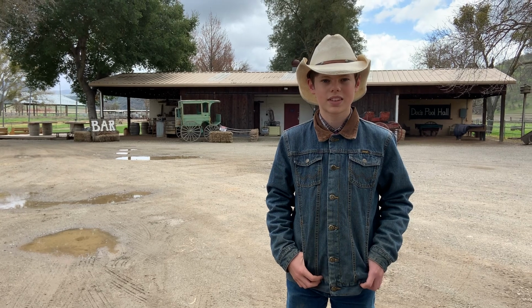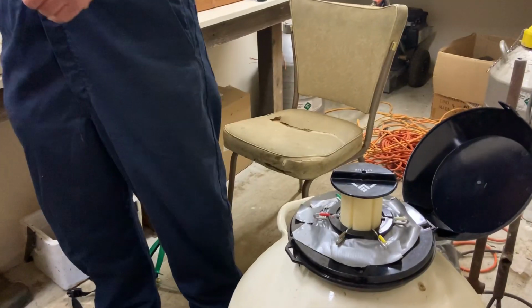Well, viewers online, we're going to take you on over to Mike Shields' property. We're going to introduce you to Charlie, and then we're going to teach you some stuff about AI and a cow. Okay, so what we're going to do today is artificially inseminate this heifer. We have synchronized her with some hormones so that we can do this on a timed basis. Since we don't know exactly when she would come in naturally on her own, we set them up on a synchronization program so that once we give them their final injection, we know we'll be breeding them about 56 hours later, and that's for the optimum results.